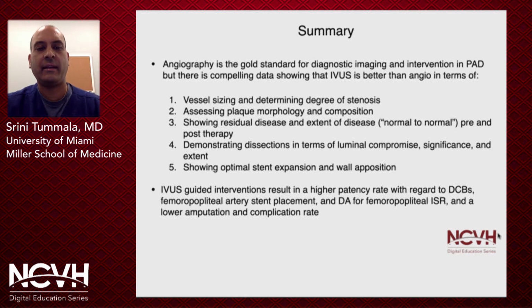And we know that IVUS-guided interventions result in a higher patency rate with regard to DCBs, FemPop artery stent placement, and directional atherectomy for FemPop ISR. And there is some data showing a lower amputation rate and complication rate.